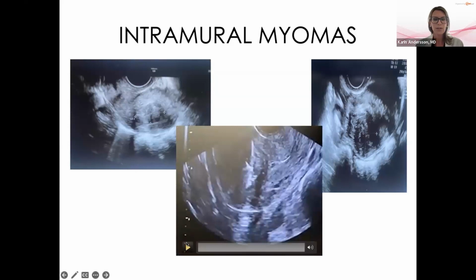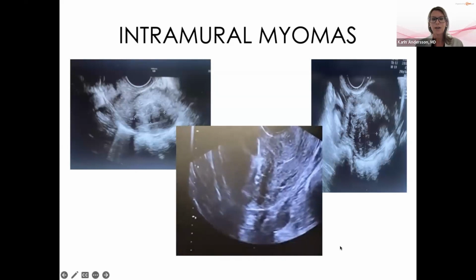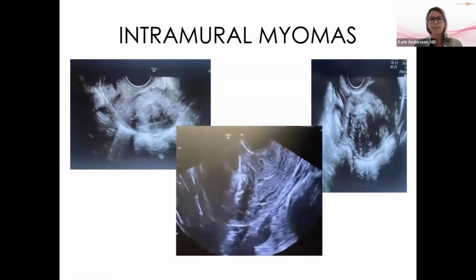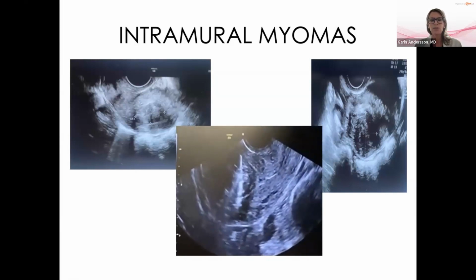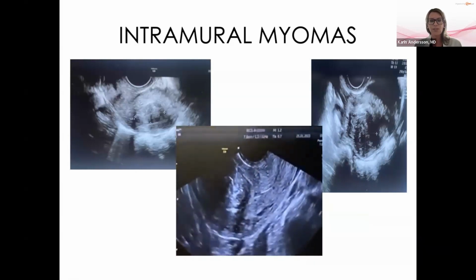I will show you quickly here how it can look when we put in the electrode. So we have the ultrasound guided assistance. When I'm performing the procedure, I'm doing it with my ultrasound probe, the transvaginal probe, inserting the electrode.